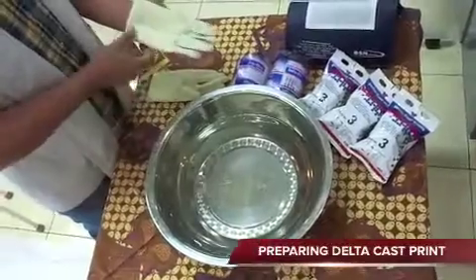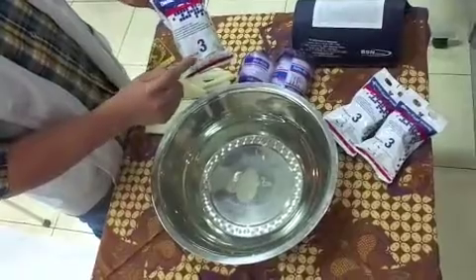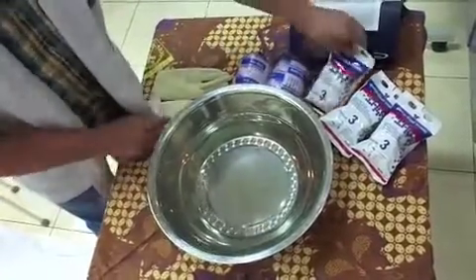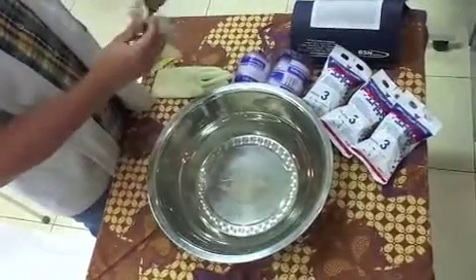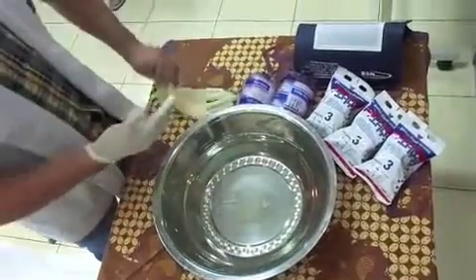Now, we will prepare the Delta Cast Print. We use Delta Cast Print with 3-inch size with the soccer player pattern. We have to wear hand gloves before applying the cast to protect the hand.